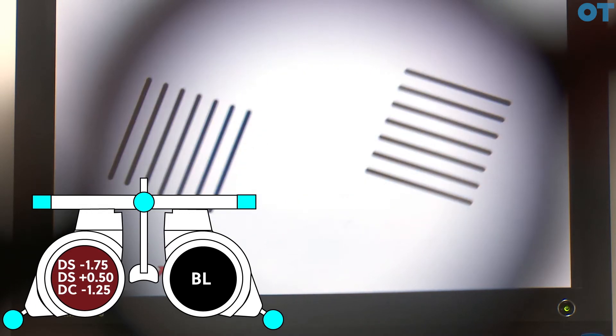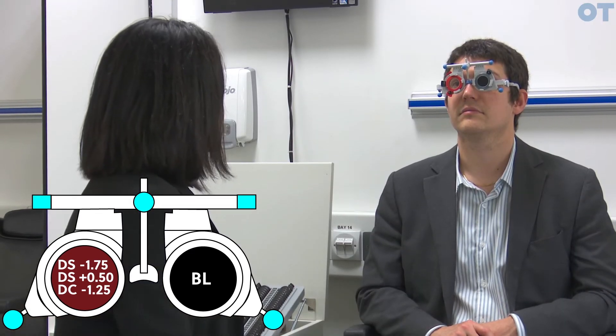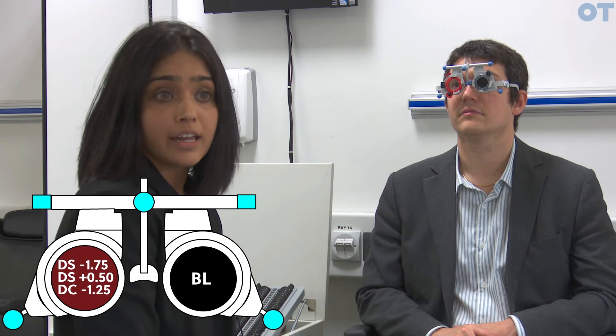Now looking at the blocks, do they look equally clear? Equally clear. This suggests that the cylindrical power has been found. If the patient had said that the left-hand blocks were clearer, that would suggest the CYL power was too strong and we would need to reduce the power to make it more positive.